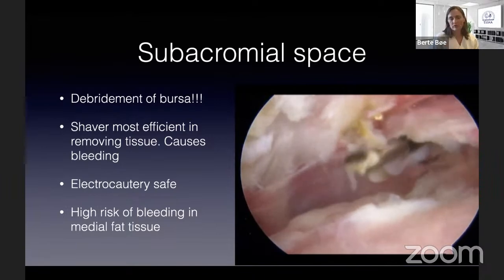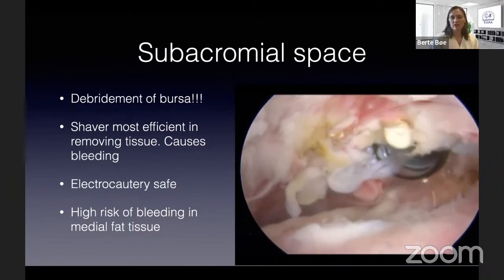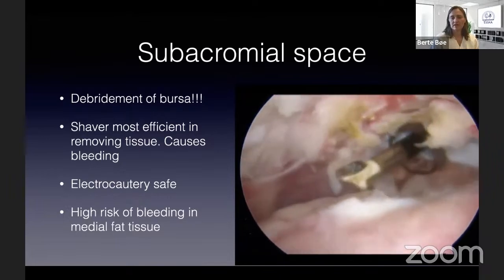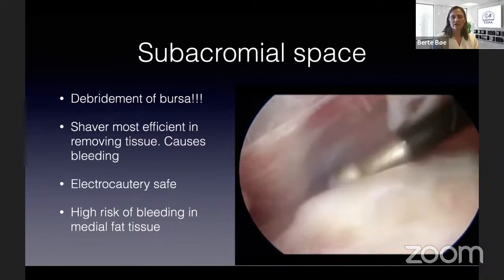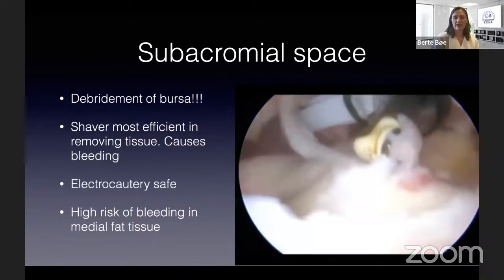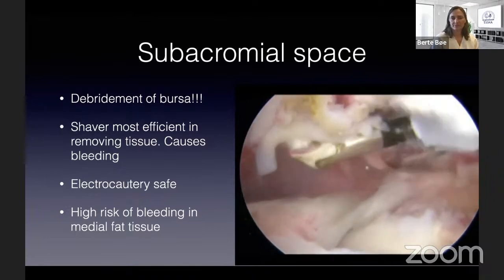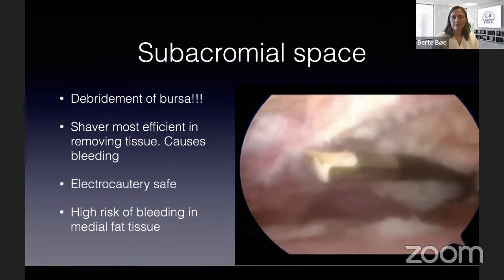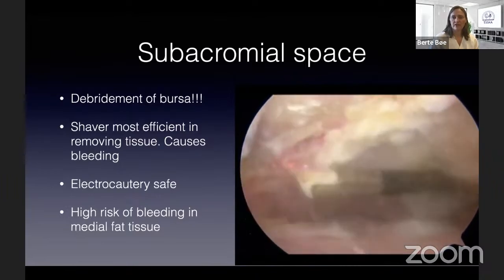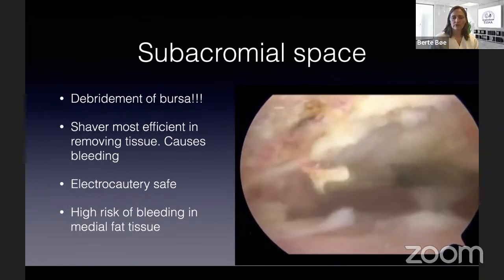So of course you have to remove enough tissue to see your rupture and see that you can place your suture properly. But I try not to go too far medial if I don't have to, because there are the bleeders. So here we still have the camera posterior and the vapor coming from lateral when I do the cleaning.